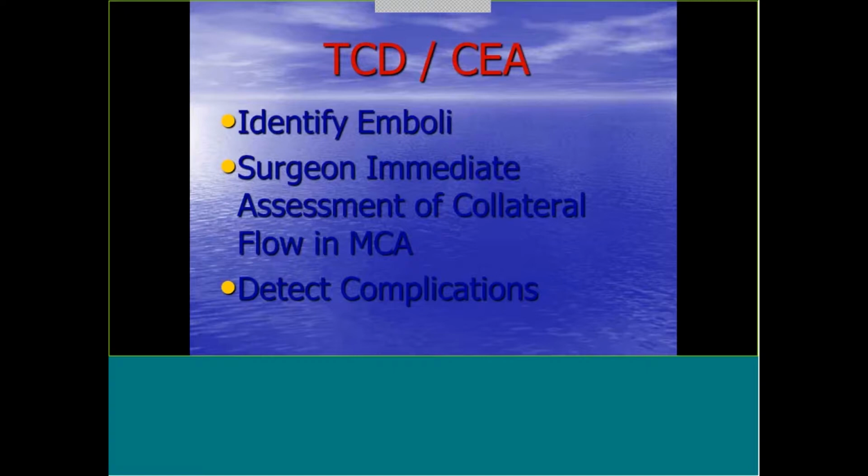So we're going to talk about a kinked shunt, the hyperemia, the hyperperfusion. You can tell them, my flows are like 3 times what they were before we started this procedure. So transcranial Doppler is an immediate assessment of what's going on in the brain. It's not comparable to EEG. EEG will give you an electrical evaluation of the transmission, but it will not give you a hemodynamic evaluation.